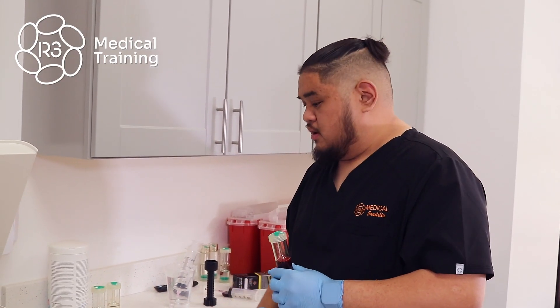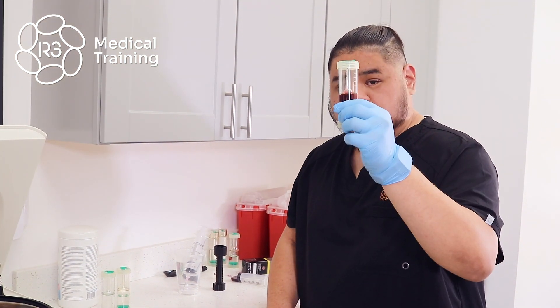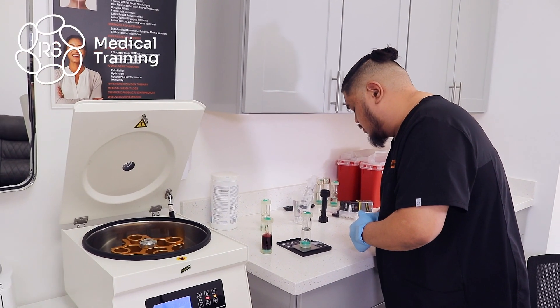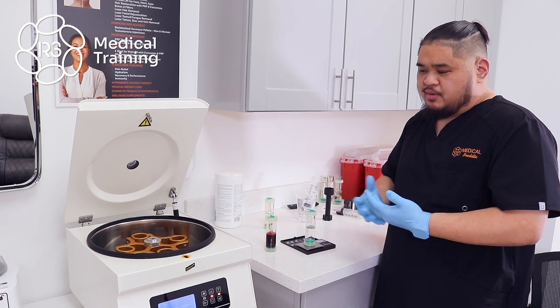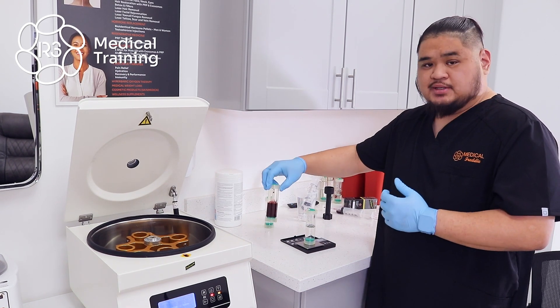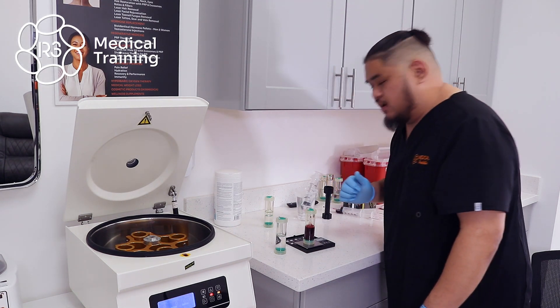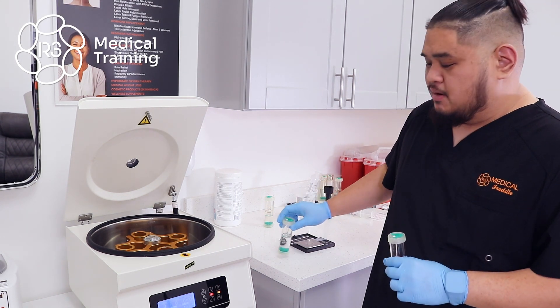Now the next step before we spin it or put it in the centrifuge is to weigh out your specimen and an appropriate counterbalance, which reads out to 75.4 grams. I'll go ahead and weigh out to make sure I'm within the appropriate weight range for counterbalancing. We have an allotment of about 0.6 grams difference in weight over and under between the blood specimen and the counterbalance. The counterbalance is 75.1 grams and the blood is at 75.4 grams, which is okay for us to now start the process of getting PRP.